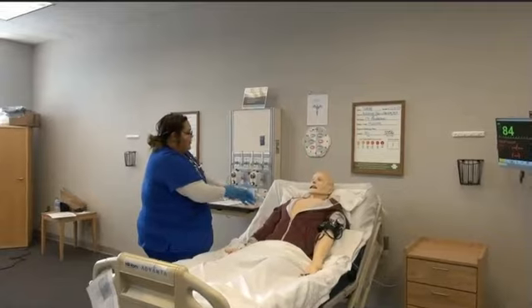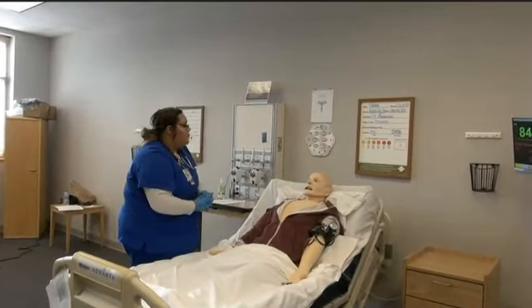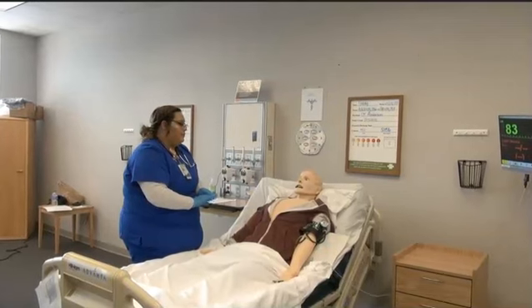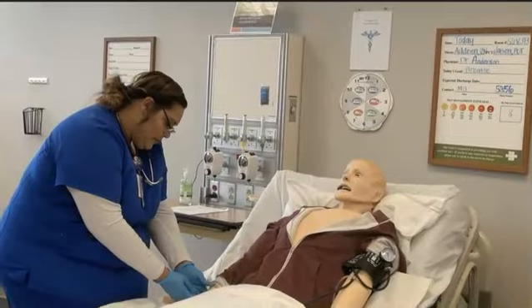My name is Maria. I am your respiratory therapist for today. May you please state your name and your date of birth? Thank you. I'm checking your wristband to make sure I have the correct patient.